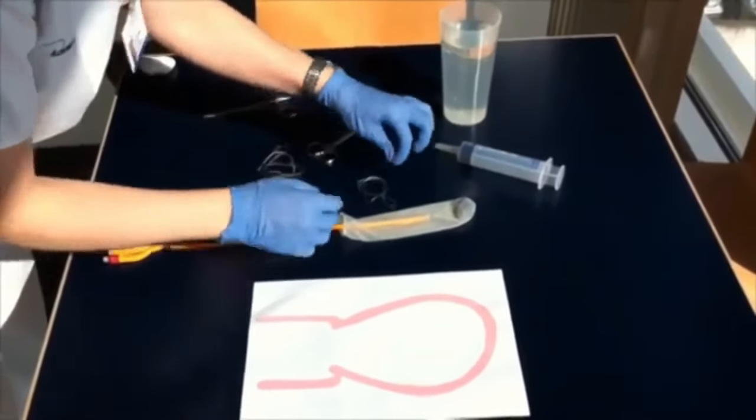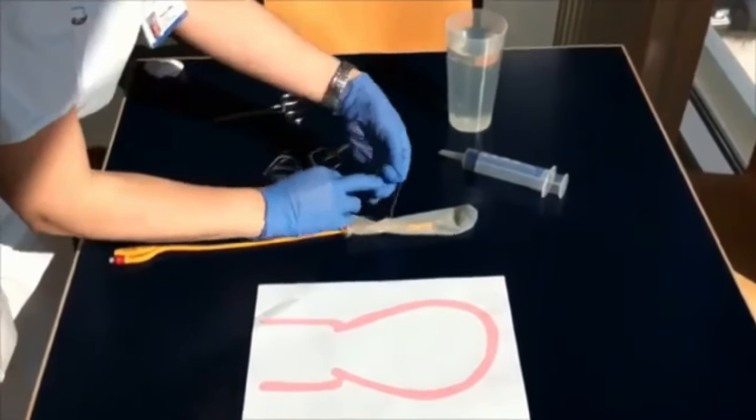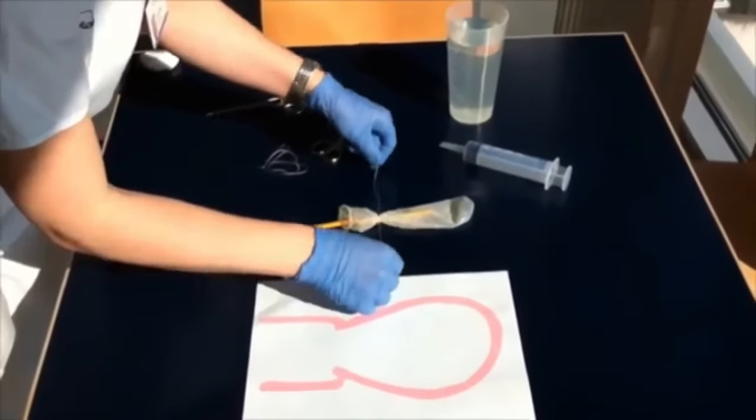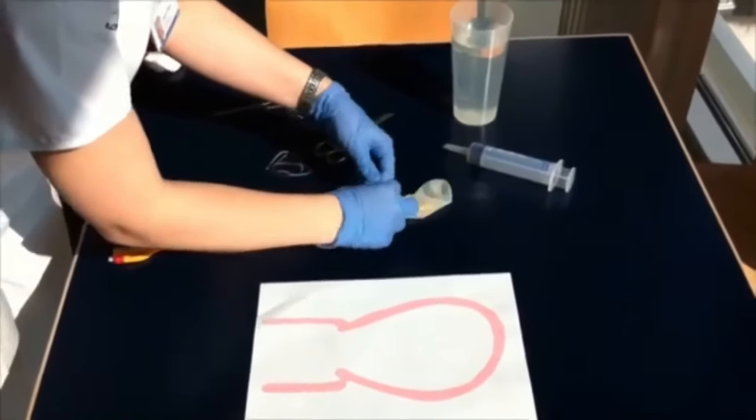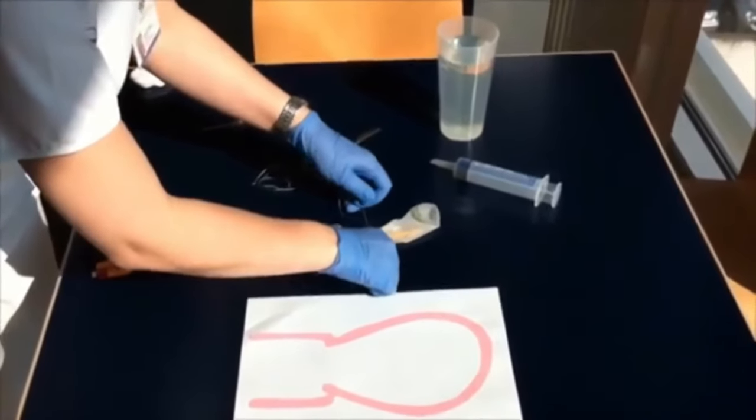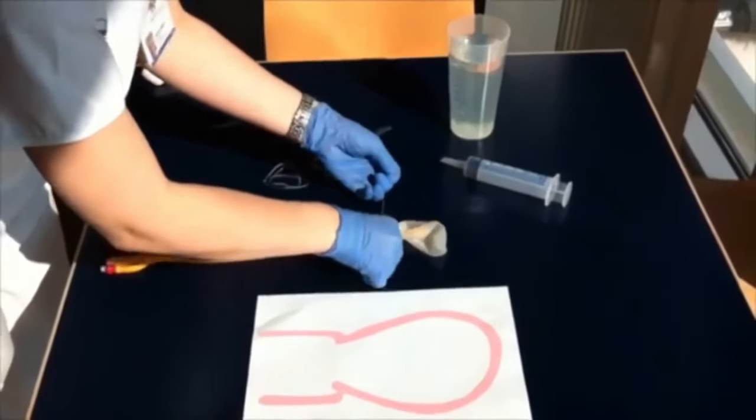Now you can see in the video that a Foley's catheter has been inserted into the condom. You should leave a little bit—one centimeter space—above the Foley's catheter, and then you should tie at the lower end, not very tightly, not very loosely, just adequately enough.